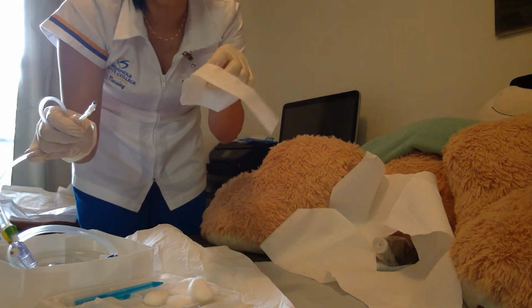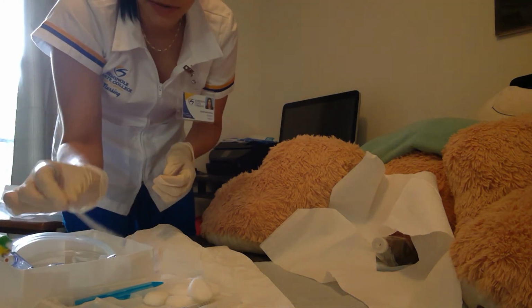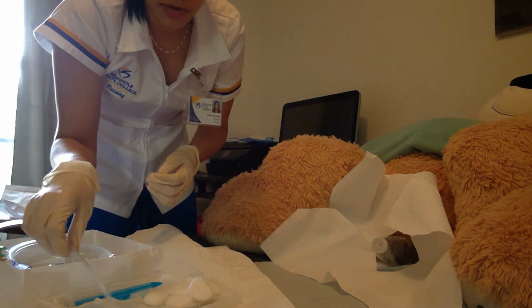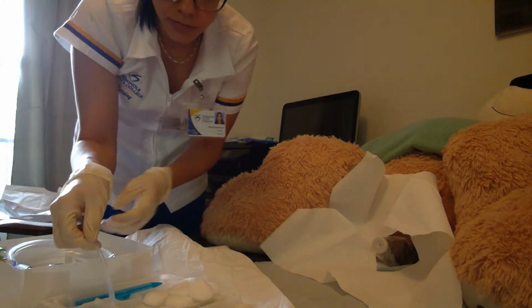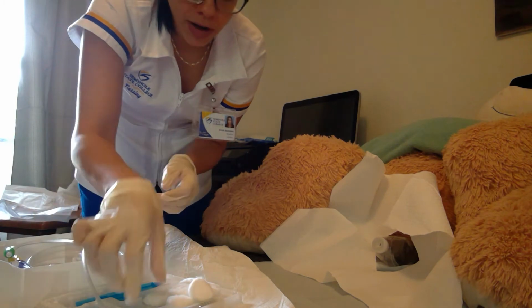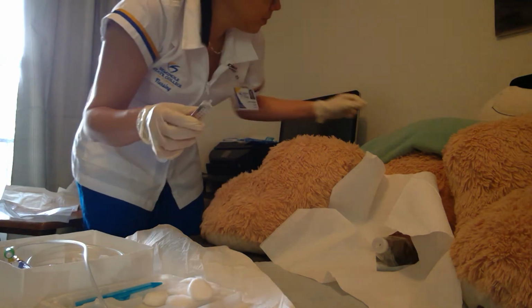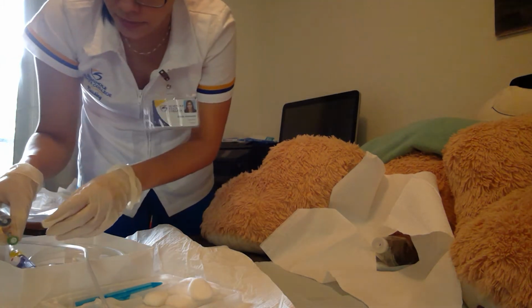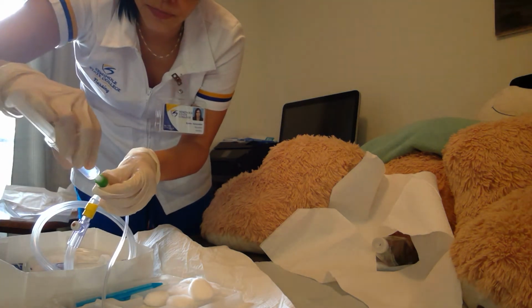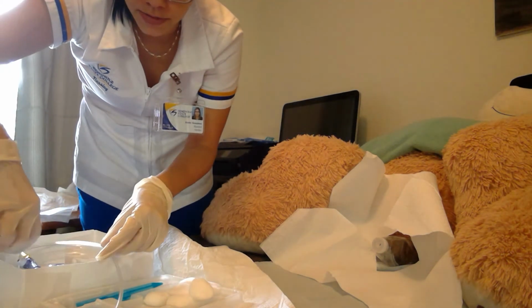And it's out. This is trash, goes in the bag. And the tip is going to go where the lubricant is. Just want to make sure that the tip is in the lubricant. Now I'm going to grab my 10 ml syringe. I'm going to take the cap off. Trash. And right here, I'm going to connect it. Making sure that it's properly connected, and it is.